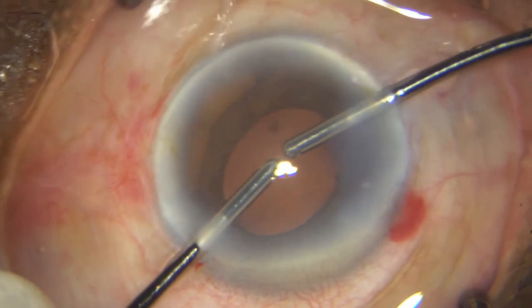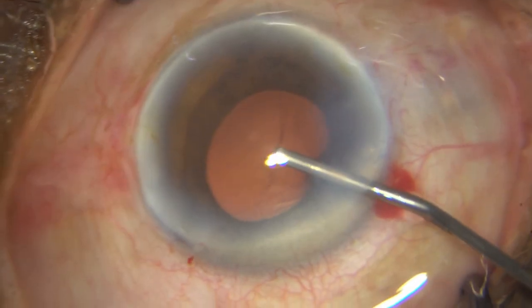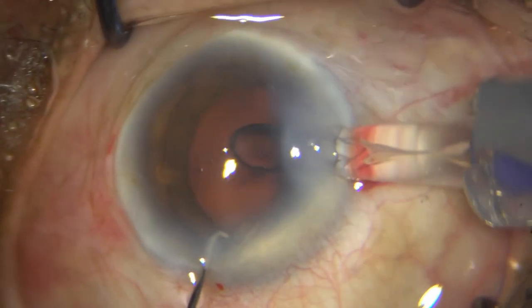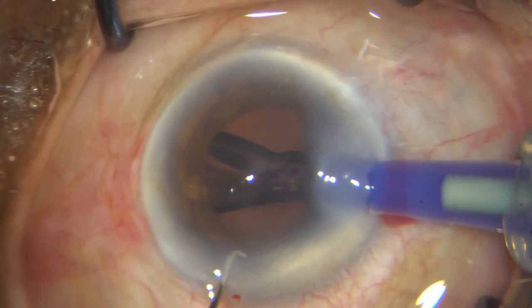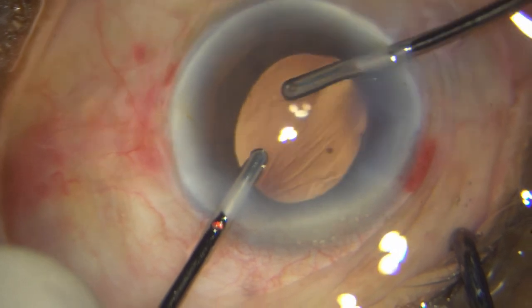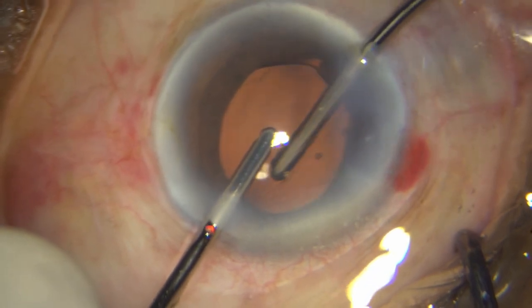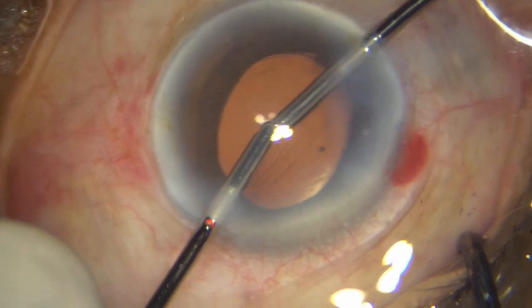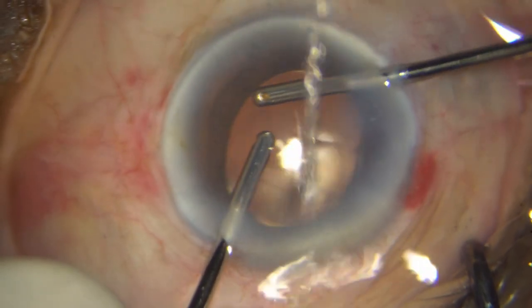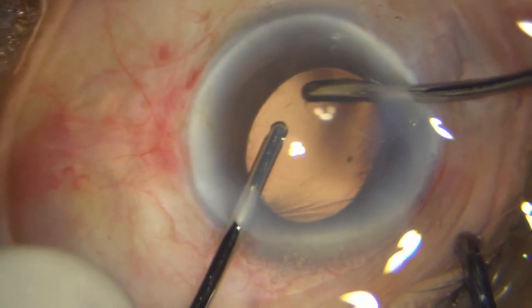I am not going to hydro-implant in this case — I am going to do it under viscoelastic. I think it is a little more time consuming but safer. There goes the lens into the bag. I then go ahead and aspirate all the HPMC. There is a little bit of hydration of the wound — I think it is not so bad with such a hard cataract. Make sure you aspirate all the HPMC. I am giving a sub-conjunctival injection as well, as the patient is a diabetic. Thank you so much for your patient watching.